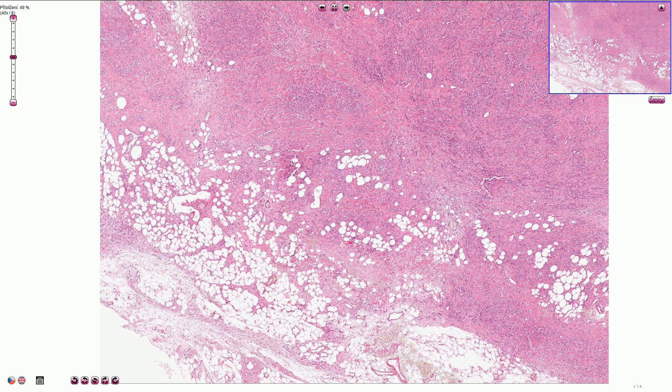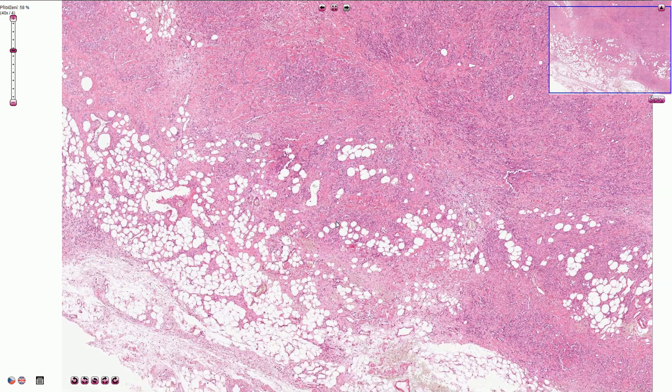Invasive lobular carcinoma is characterized by loss of the normal cell adhesion. Most cases are associated with lack of E-cadherin, which is a protein that keeps the cells together. Less commonly, in a minority of cases, some other adhesion proteins can be missing as well. This lack of cellular adhesion is responsible for its specific morphological appearance, which is very typical and important for lobular carcinoma.